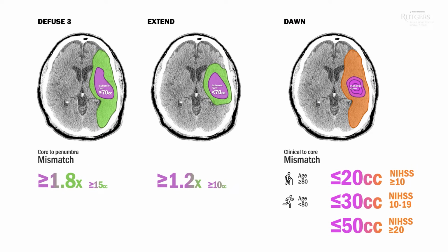Okay, take one last look at the criteria because we're about to apply them to real cases.